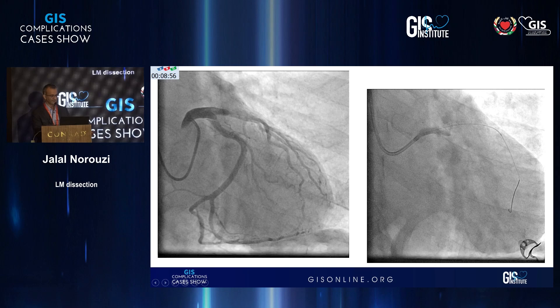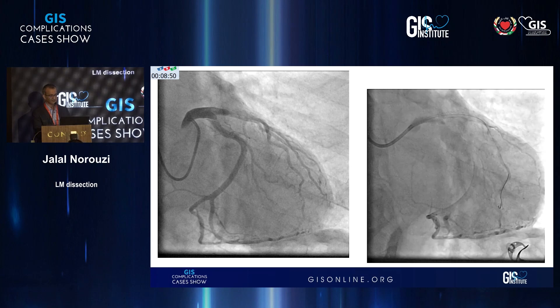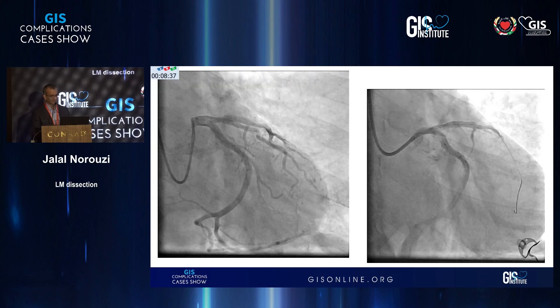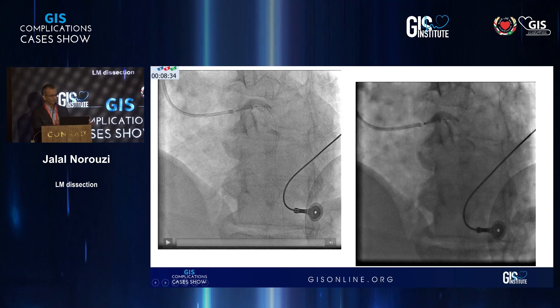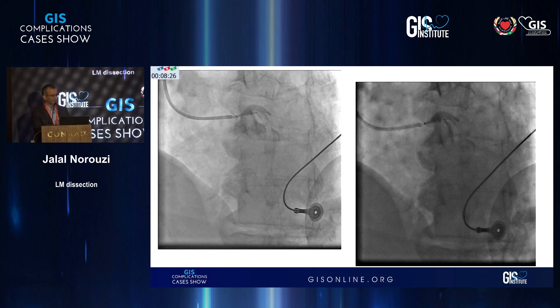No further injections. What we do usually, and everyone else does, is rapidly change to a guiding catheter. We put the wire in the LAD and we did try to wire the LCx, but because it was a little bit difficult, we didn't want to do any injections. We accepted the LAD wiring and then we decided to just stent from the ostium, because the ostium was where the catheter had caused this iatrogenic dissection.